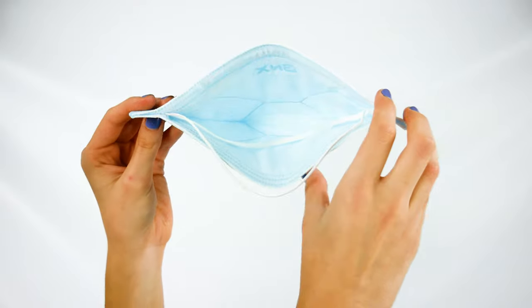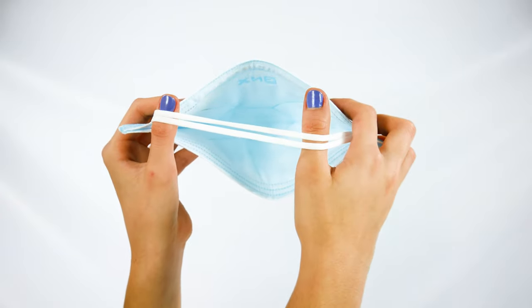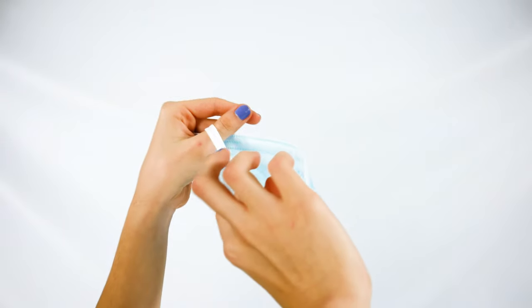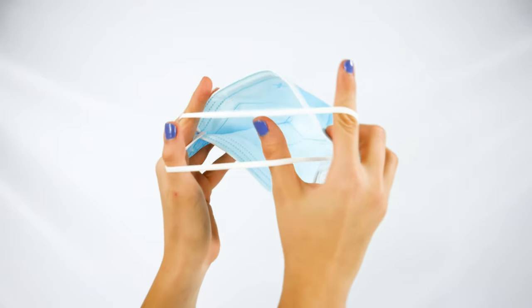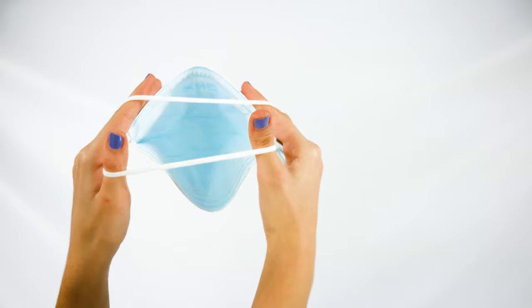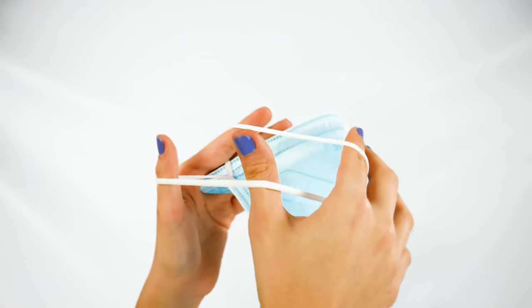Open up the mask and take out the headbands. Stretch them out with your thumbs. Place your index fingers under the longer bottom band and bring it up. Keep your thumbs under the shorter band so you're holding both bands with your thumb and index finger like so. It's very important to do this because otherwise the mask might feel too tight.